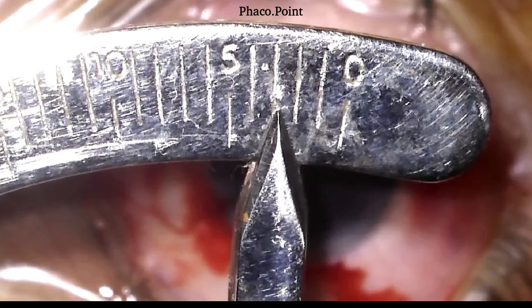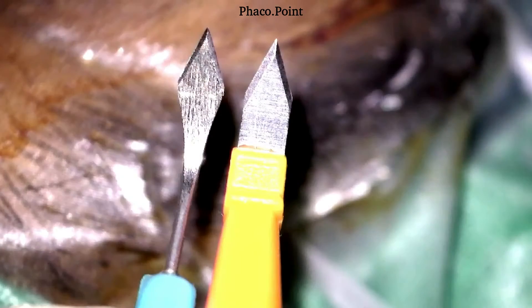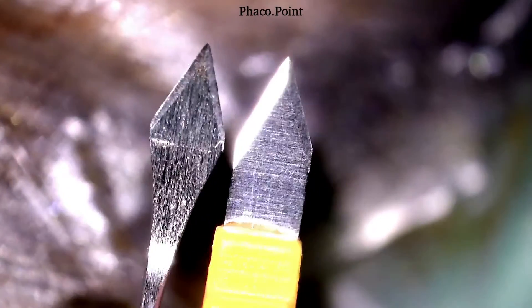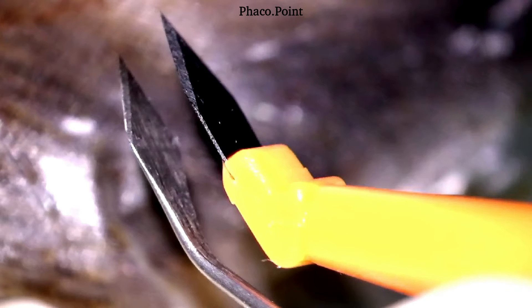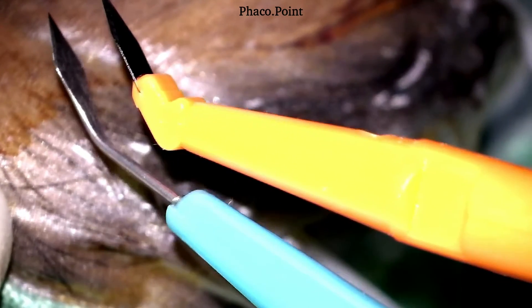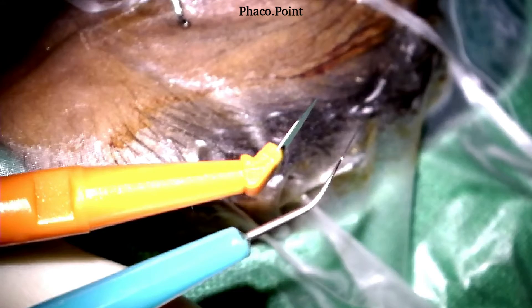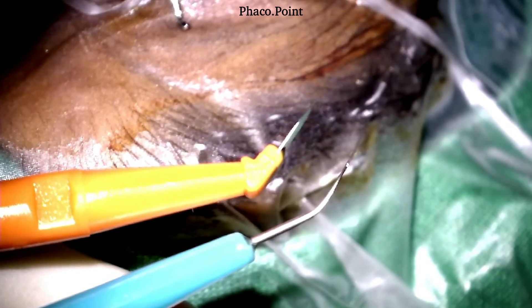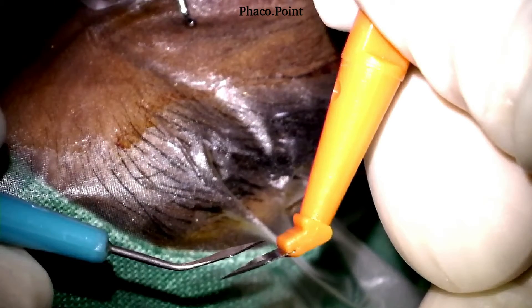Let's go through the visual dimensions of this keratome. The 2.8mm width is similar to the previous keratome, and this is a comparison of both keratomes visualized simultaneously — in almost all aspects the tips are exactly comparable. The only real difference I found between both keratomes is the proximal hub angle. With the orange-handled keratome, which has the parallel blades beyond the shoulder, the proximal hub angle is slightly more acute compared to the blue-handled keratome. In practice, you may need to hold the orange keratome slightly more anteriorly to achieve the exact same incision.